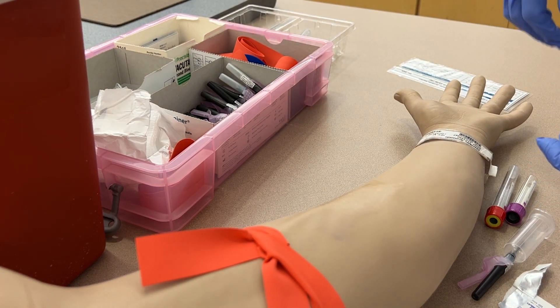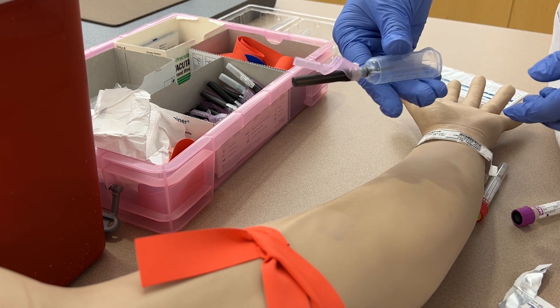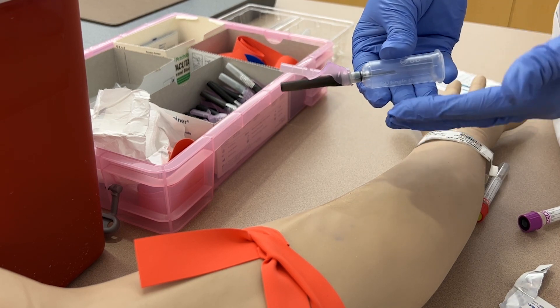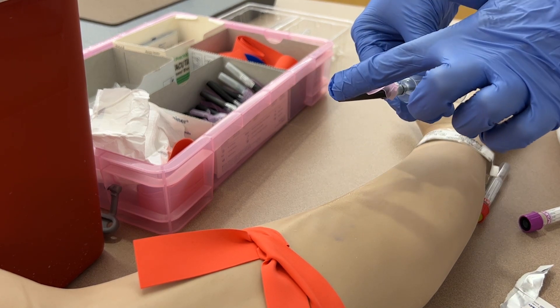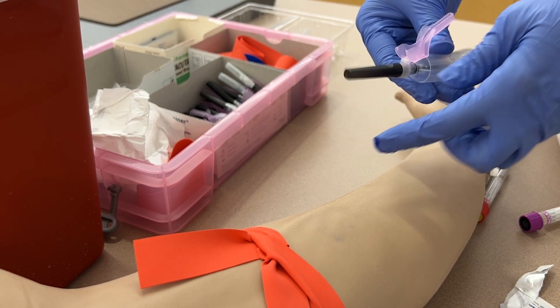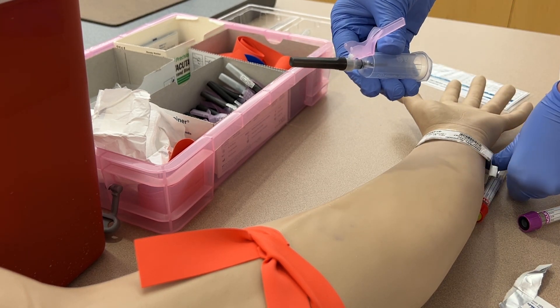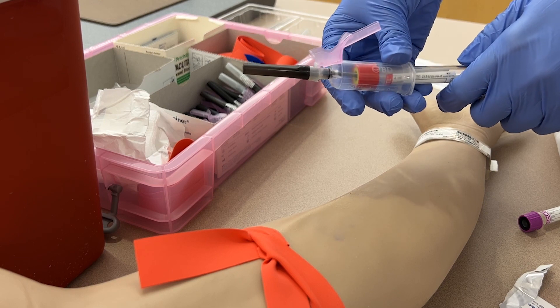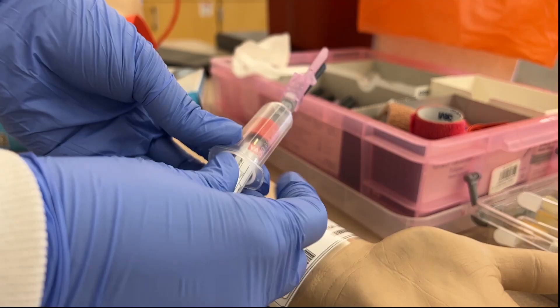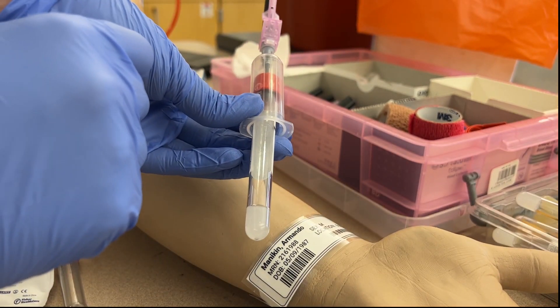While the alcohol is drying, grab the tube holder and needle and hold it in your dominant hand with your thumb on top and fingers on the bottom to maintain good control of the needle and good contact with the patient's skin. Pull back the safety feature — these are designed so that the safety feature is in line with the bevel — and then dock your first tube. To dock it, don't push the tube all the way onto the needle as that would clear the vacuum, and spin the label so it's facing down so we can see the blood drain into the tube.